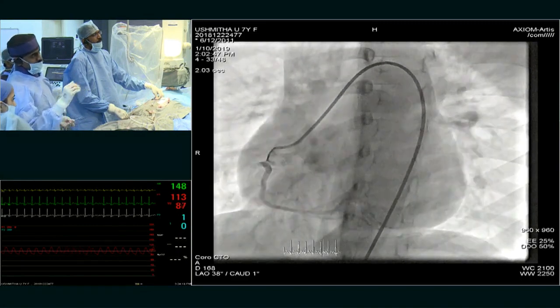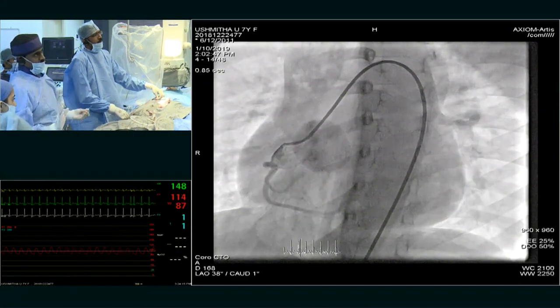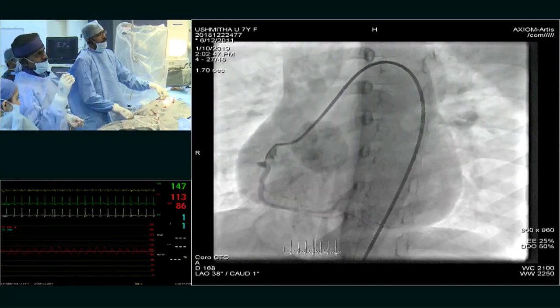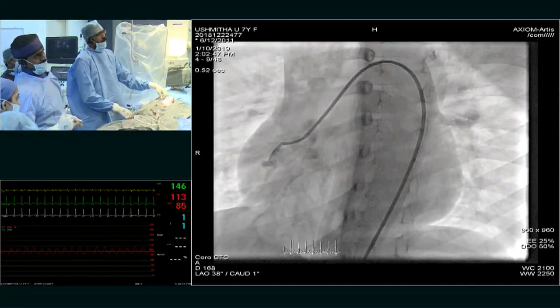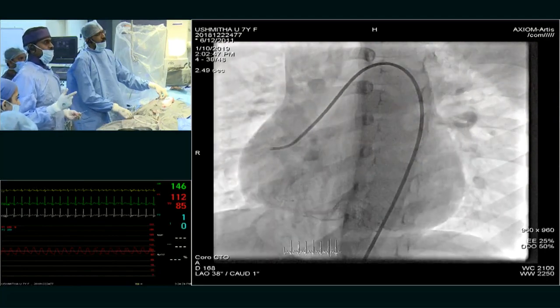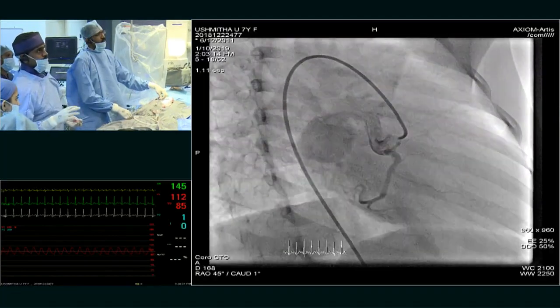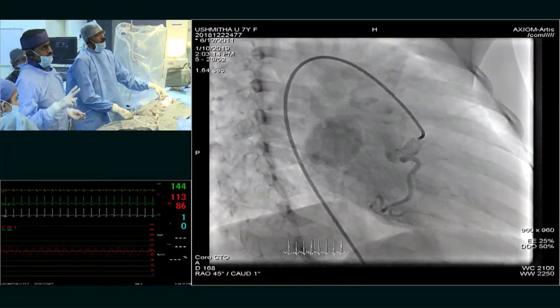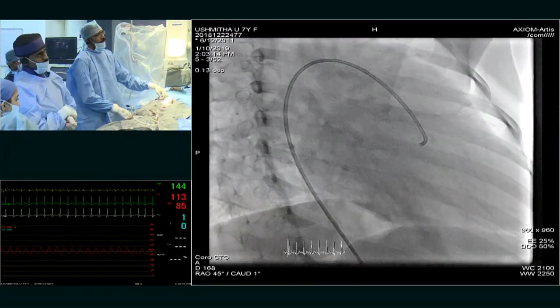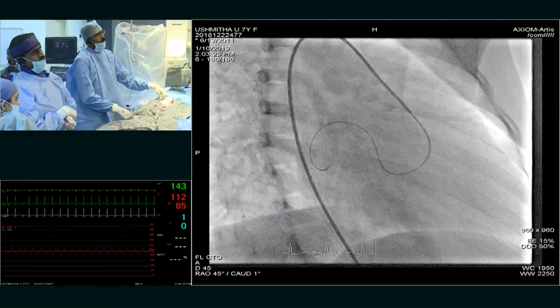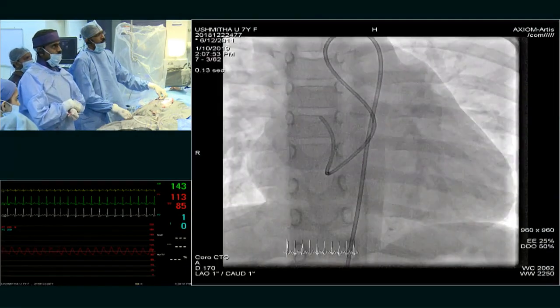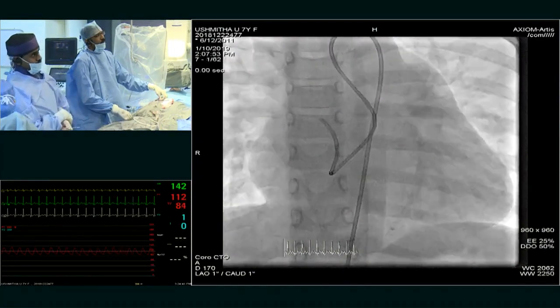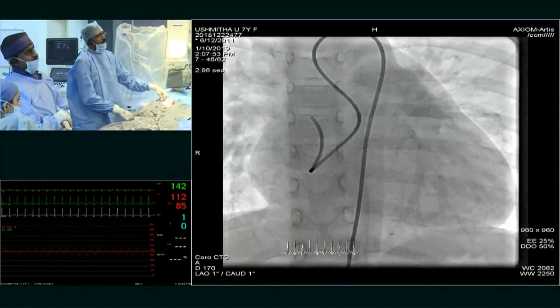We have entered into the descending limb and we are injecting — this is the right coronary artery. At the summit of the descending limb is the RCA and then there is an ascending part. We then advanced into the aneurysmal sac, and in that aneurysmal sac we can see the exit point.